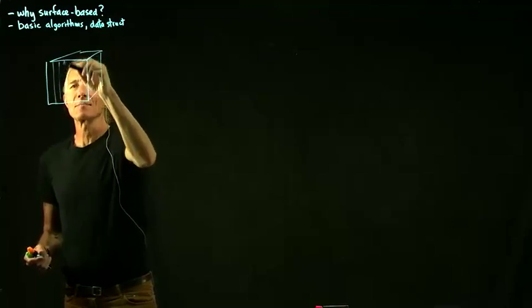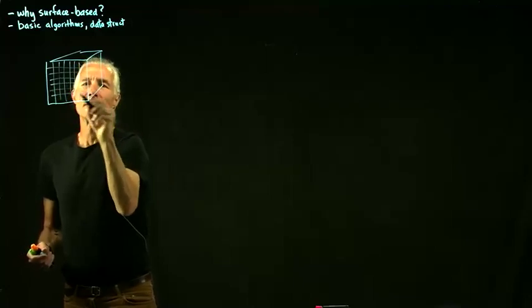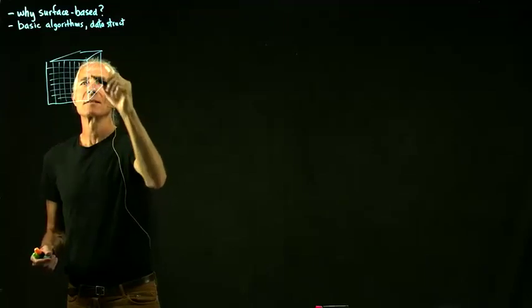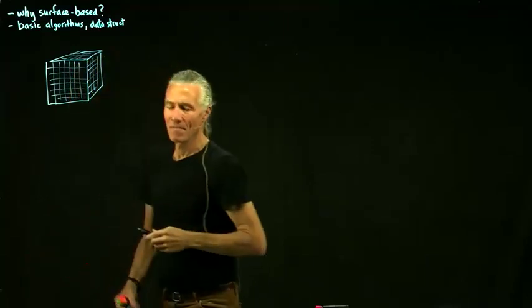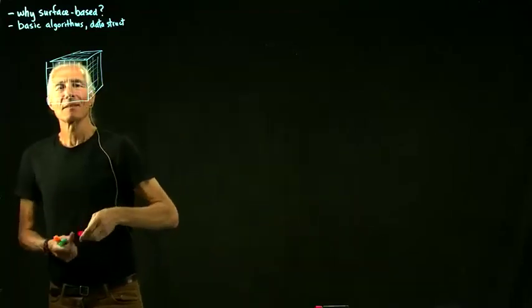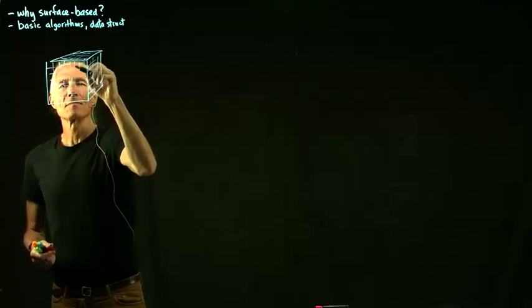You have slices, but basically you've got this three-dimensional block of voxels. That's your basic data structure. So it's natural to imagine analyzing that as a three-dimensional block, and it has a brain inside of it. So here's a brain inside of it.